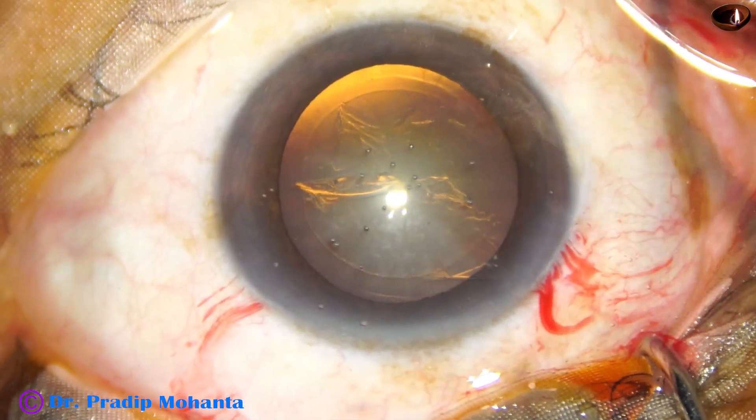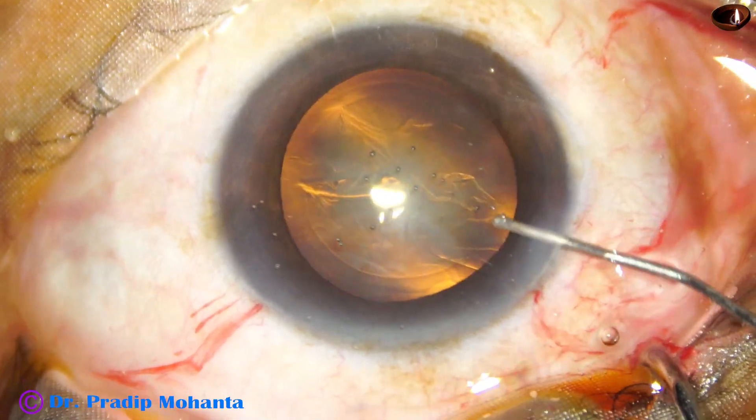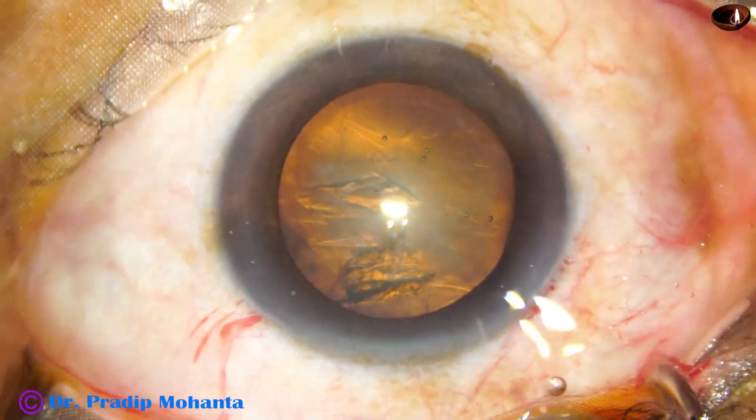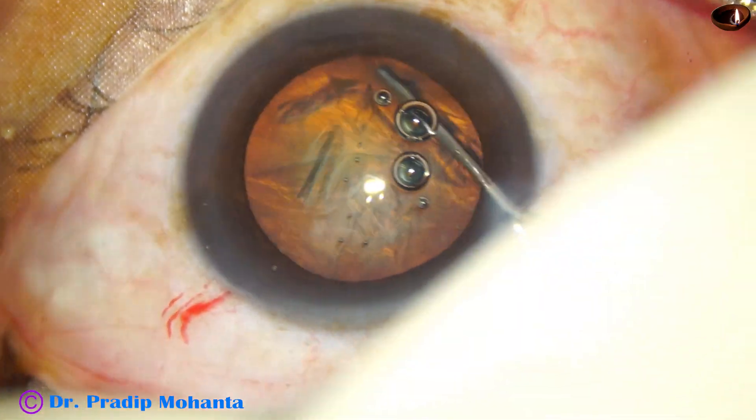Rhexis is done. And now hydro-dissection. The fluid wave goes to the other side. Nucleus is tapped and rotated.